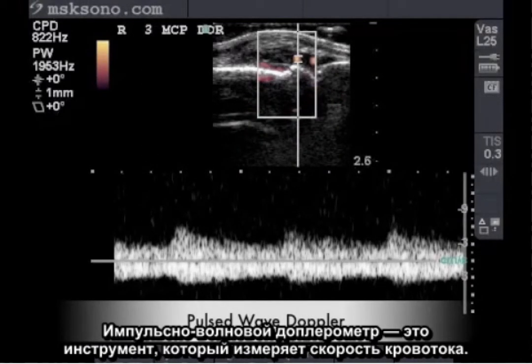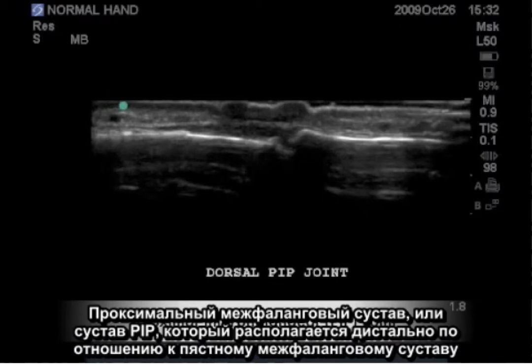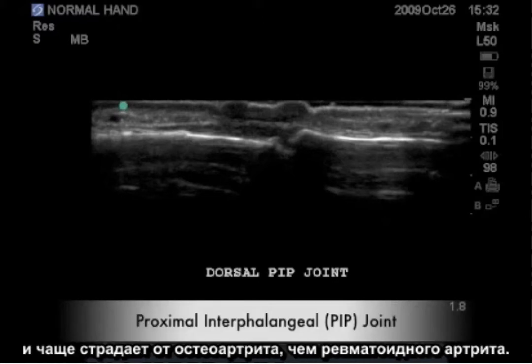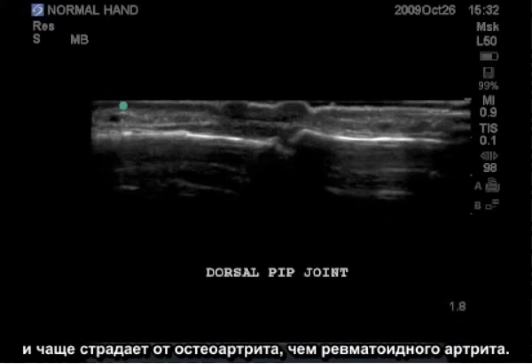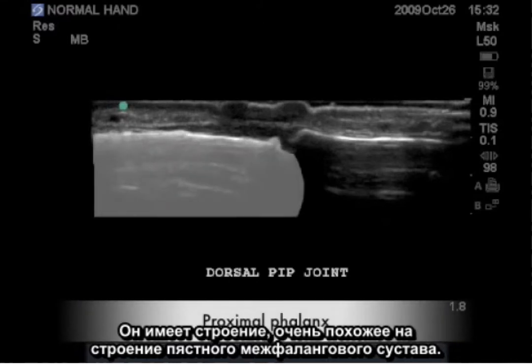Pulsed wave Doppler is a tool that measures the velocity of blood flow. We will now look at a similar joint — the proximal interphalangeal joint, or the PIP joint, which is distal to the metacarpophalangeal joint and more commonly affected by osteoarthritis than rheumatoid arthritis. It has very similar construction to the MCP joint.